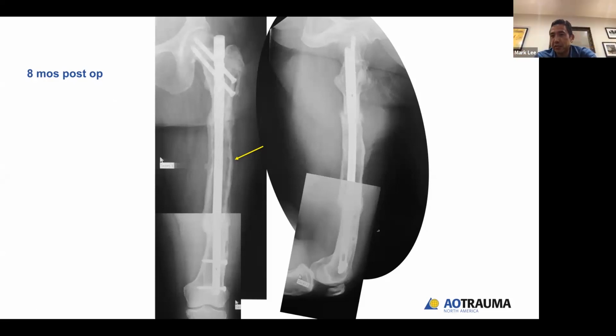Yeah, I think it's a nice concept. We bypass an area of pathologic bone and we induce bridging healing that incorporates that site. I find the most utility with it in areas where I'm dealing with a really pathologic segment, for example a congenital pseudoarthrosis. But I do bone graft these. We didn't talk about that. I usually do bone graft my transverse sites as well as my clamshell site. And when they heal, they do get a very nice new callus formation, and I feel like you can get continuity that bypasses and envelops a non-united area. They are implant dependent, but many of the things we do are implant dependent. You get an implant dependent union that's quite functional and long lasting. So I think it's a very reasonable idea. Yeah.